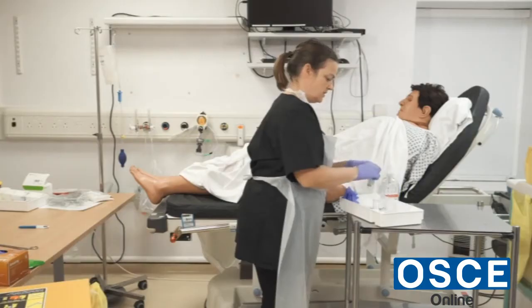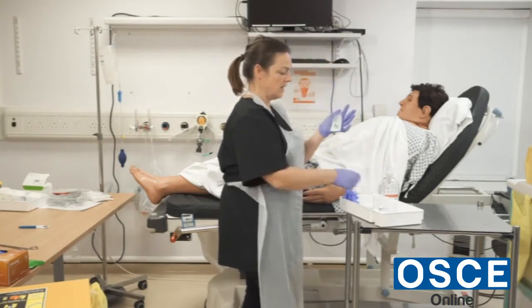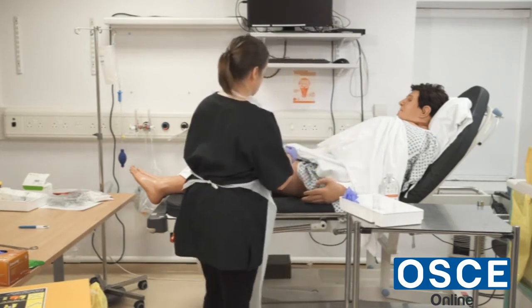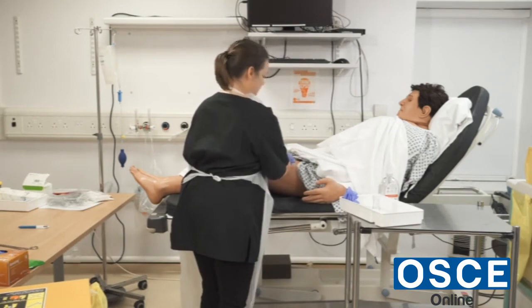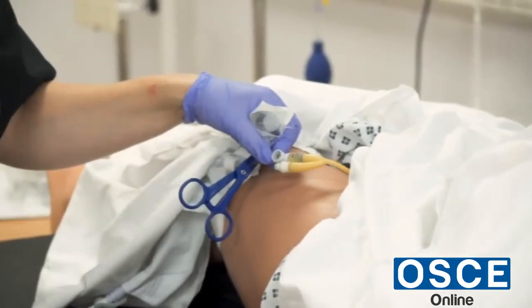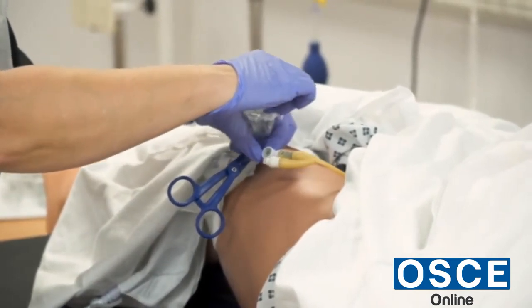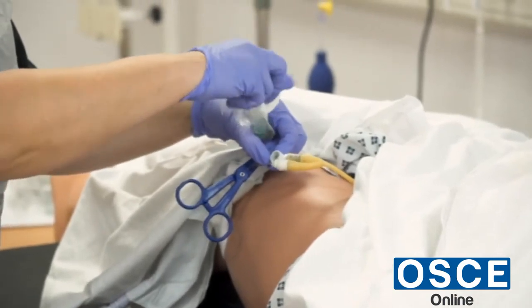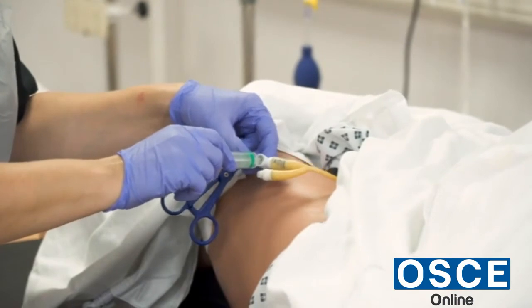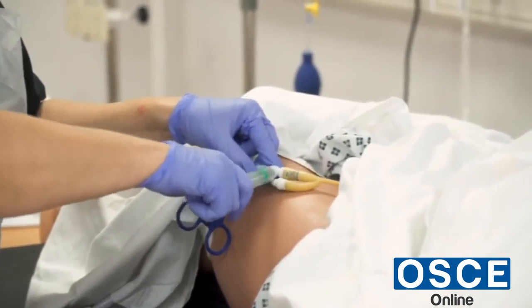These two things can be done at once — you can hold the syringe in your hand and hold the alcohol wipe in the other hand, and clean the port. That would be done for 30 seconds. Allow 30 seconds to dry, then take this syringe out of the packaging and apply it to the needle-free port. There's urine in the tube now.